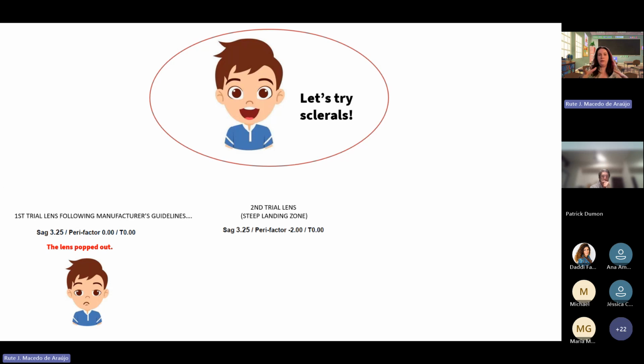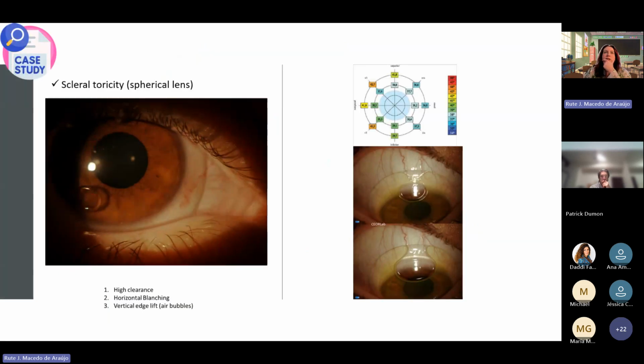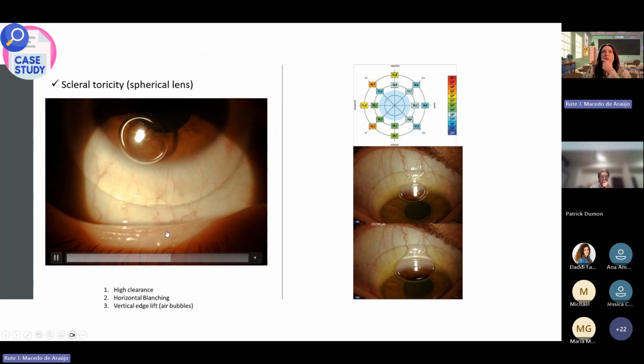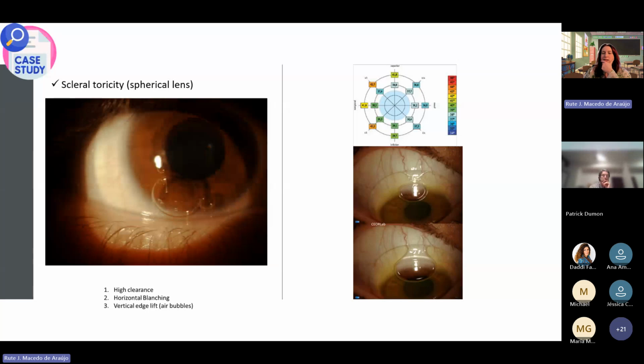So I changed the periphery to be more tight, and the lens popped out again. So I was like, okay, I need the lens to be even steeper. So I ordered another lens. Here I am only changing the peripheral factor, not changing the toricity or any other parameter. And what happened? This happened. There was blanching on the horizontal meridian, and on the vertical meridian we can see some air bubbles entering. So, a case of a high scleral toricity.